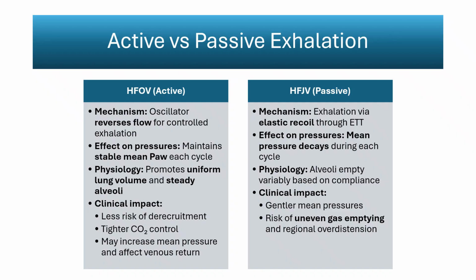Exhalation mechanics distinguish high-frequency oscillatory ventilation from high-frequency jet ventilation and largely define how each mode behaves under changing lung conditions. In HFOV, exhalation is active. The oscillator piston or diaphragm reverses direction with equal force during expiration, pulling gas out of the airways as effectively as it pushes it in.